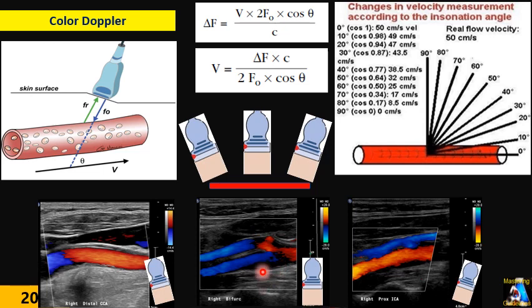Or there is some pathology, like a hypoechoic plaque, fresh plaque, or blood clot there, and it doesn't register any blood flow. So for that, we have two options. We do steering at this level, or heel-toeing and steering, and see if we can see any blood flow.